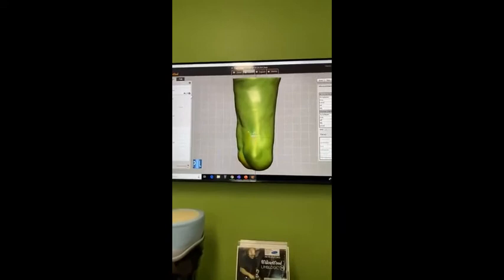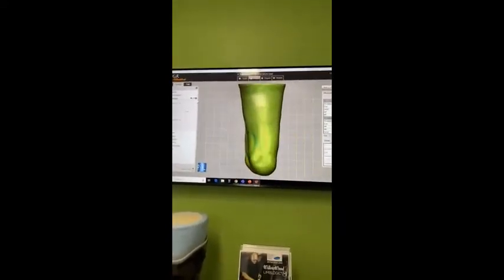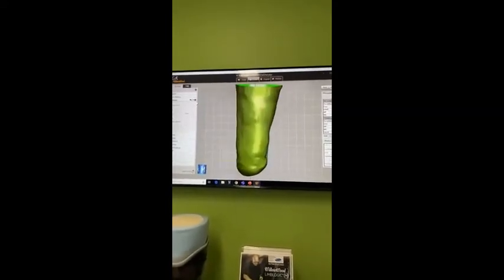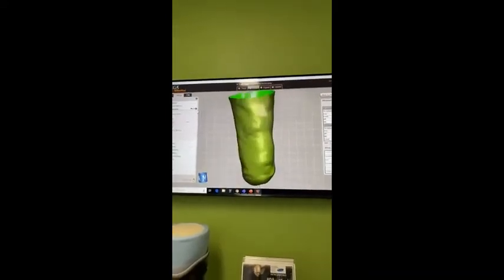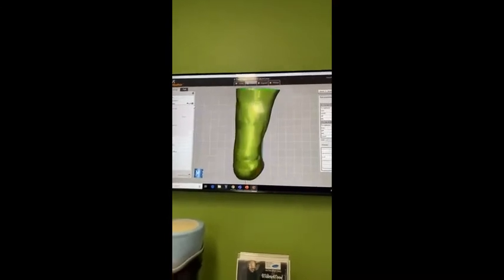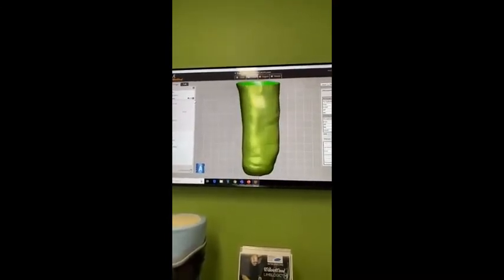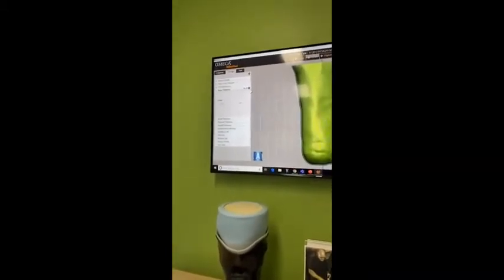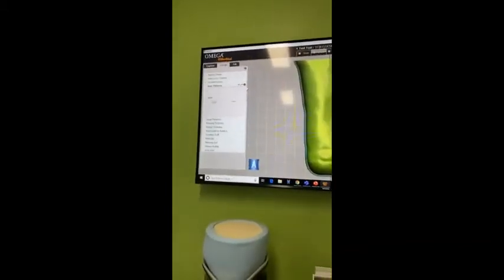So also, if on the previous in the capture stack, if you weren't able to capture the invagination as deep as you would, you could make that area a bit deeper by using the remove area tool. So then we basically just start with the base thickness. So if you want to start with a 6mm liner, you would start with a 6mm base thickness.